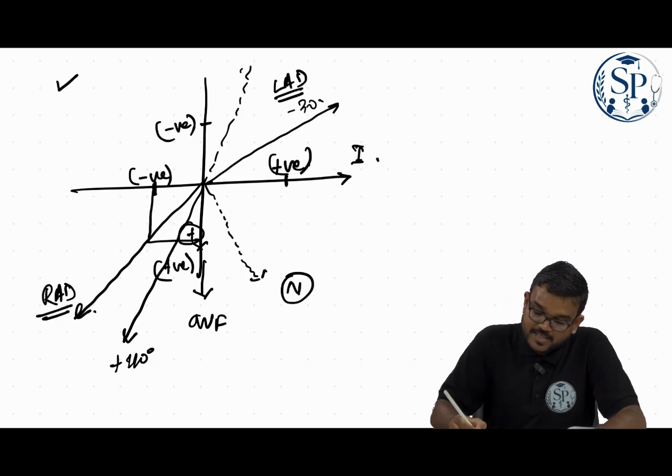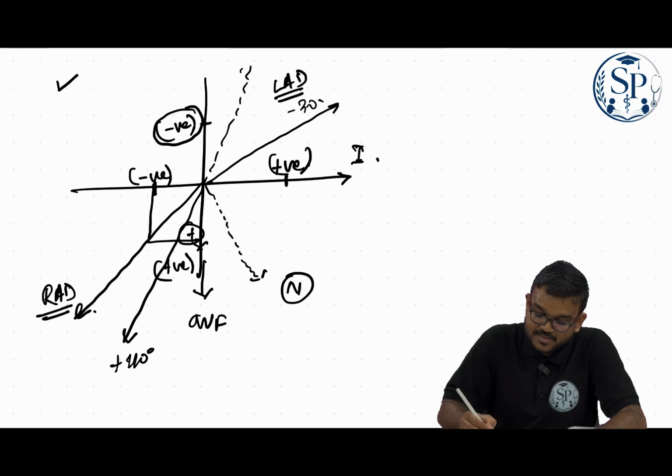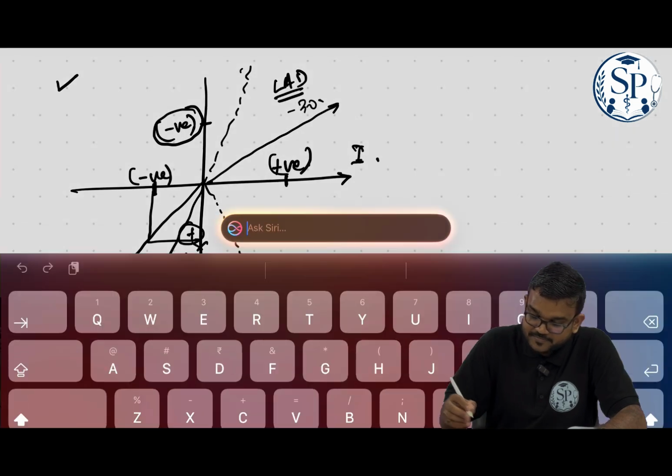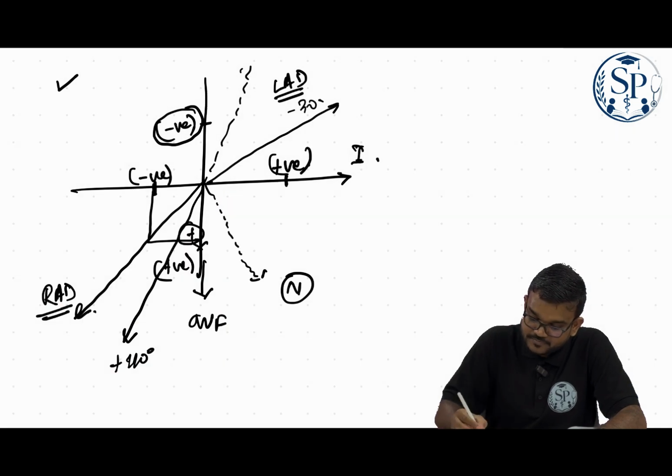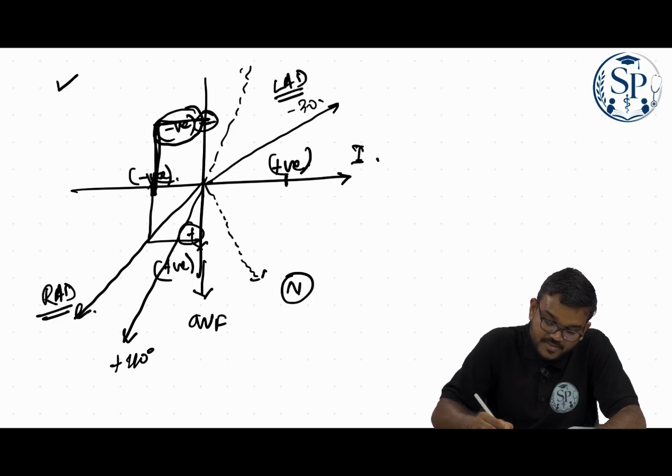Okay, the R minus S is negative here in lead 1, and the R minus S in AVF is negative in this direction. So the resultant will be like this, in this manner.